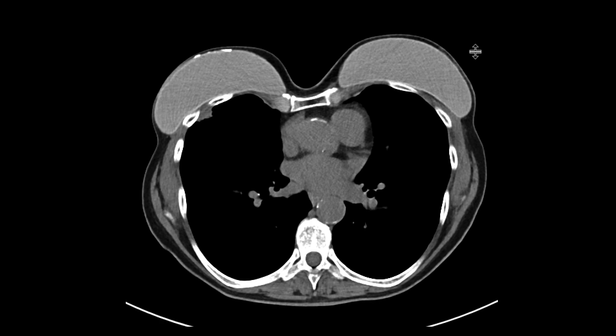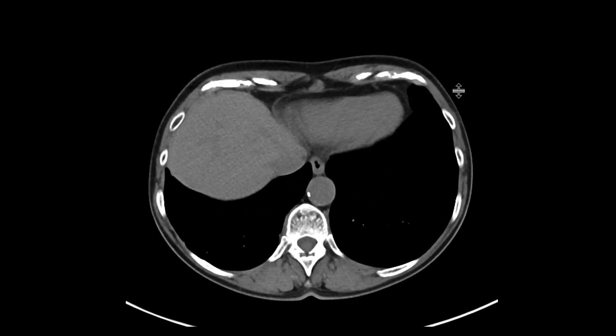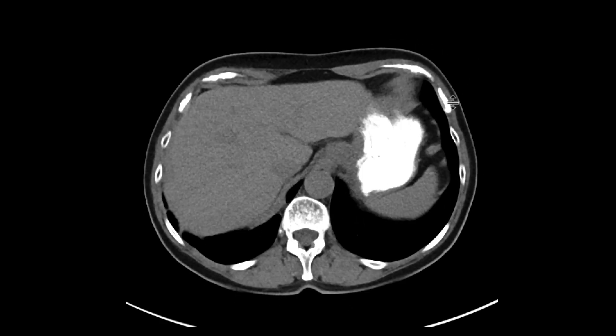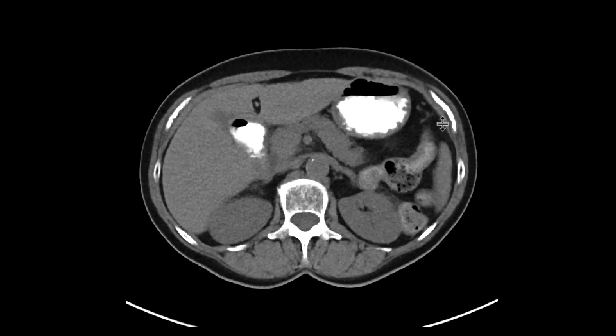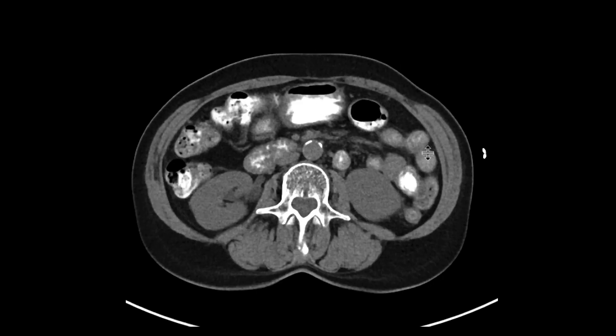This is a patient who came in with some abdominal pain, and we did a non-contrast CT. We did get some oral contrast.